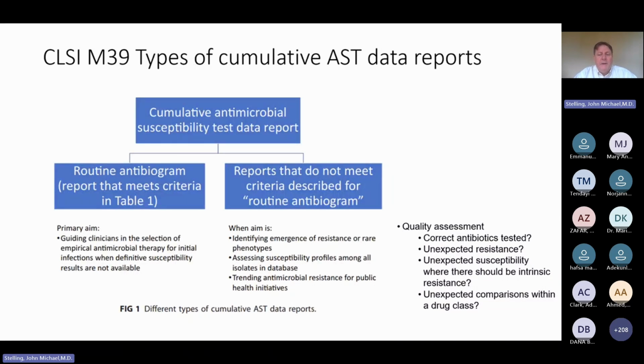That would be expected. The gentamicin resistance is higher. But sometimes you'll see it's opposite, that the amikacin resistance is higher. It is biologically plausible. It is possible for an E. coli to be amikacin resistant, but gentamicin susceptible, but it doesn't happen very often.